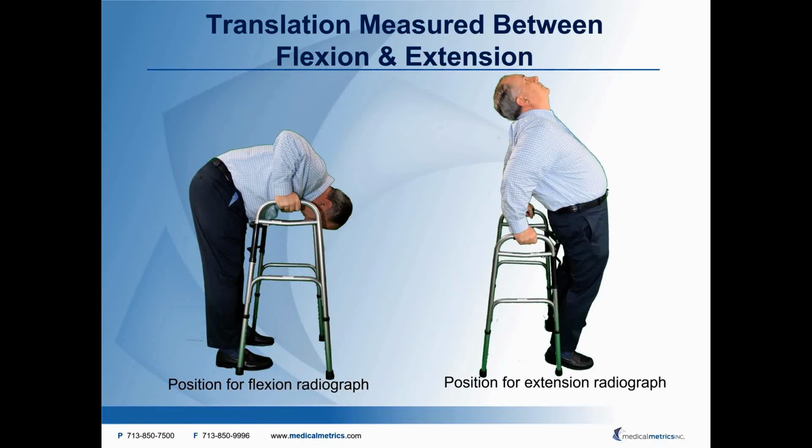The intervertebral motion is measured from radiographs taken with the patient flexed forward and with the patient extended backwards. Good patient effort is important. Since this is a typical activity of daily living, there is minimal risk in asking a patient to briefly hold a flexed or an extended position for the brief time required to obtain good quality radiographs. The importance of patient effort will be discussed later in the presentation.